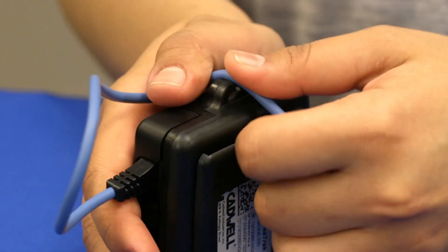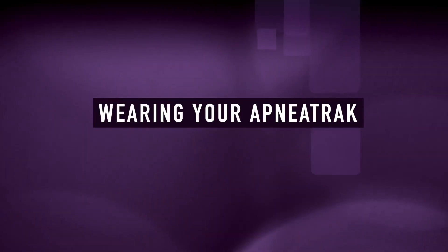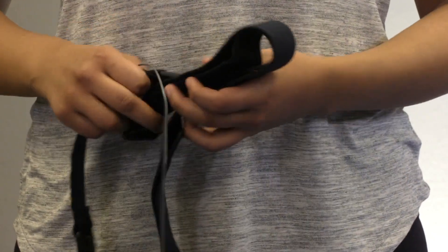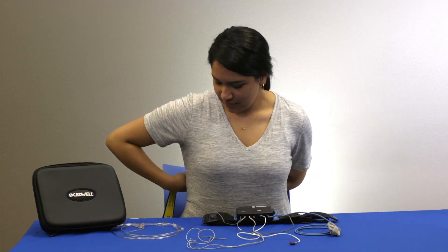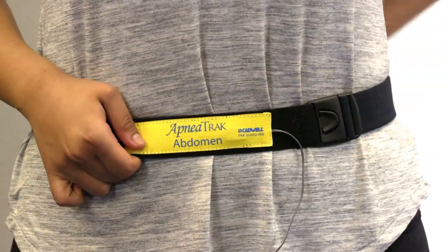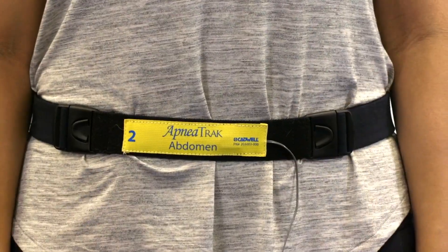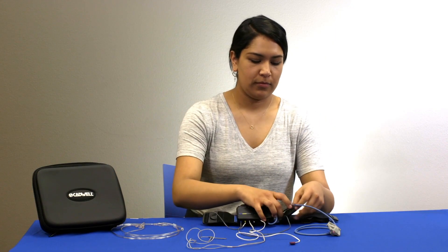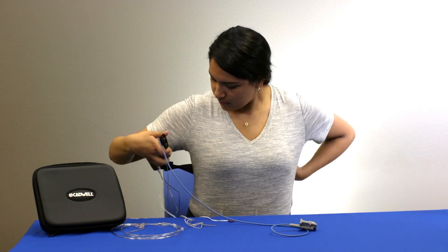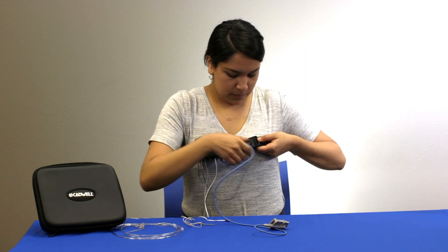Press the oximeter cable through the hook on the side of the apnea track. Fasten the abdomen belt around your stomach, across your belly button. Adjust the abdomen belt to a comfortable and snug fit using the Velcro straps. Place the chest belt around your chest and fasten the buckle. Ensure that the chest and abdomen belts stay in place when you are standing.